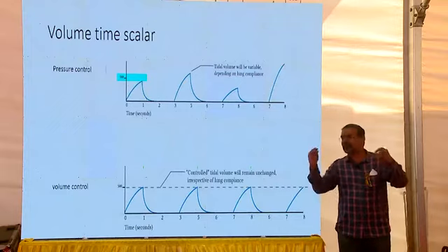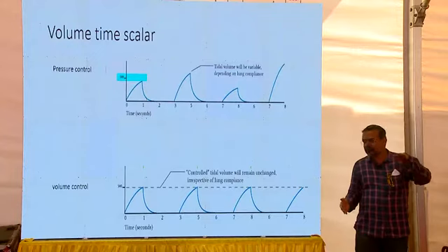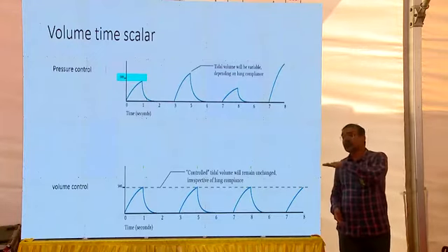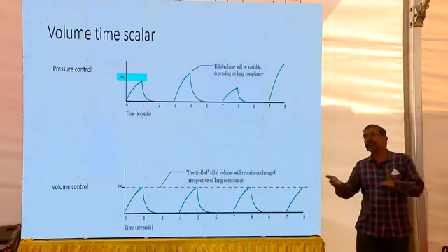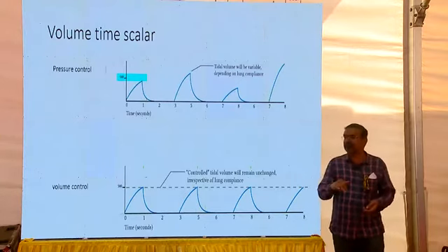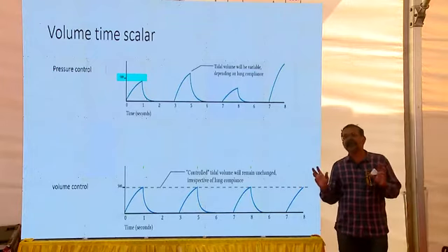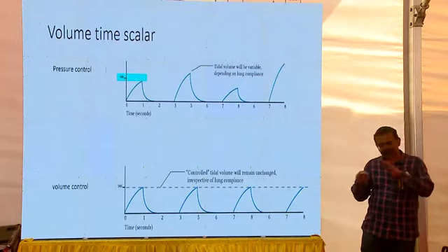Because of volume, there is a lot of atelectasis. That's why HFO works wonders there. So with volume, usually they have inborn babies, they ventilate the baby early, the outcomes are good, but their HFO use is more. With pressure, usually outborn babies, they get babies late, non-homogeneous, non-pulmonary problems, oxygenation problems, and their outcomes are moderate. So we can't compare apples with oranges. These are two different things.